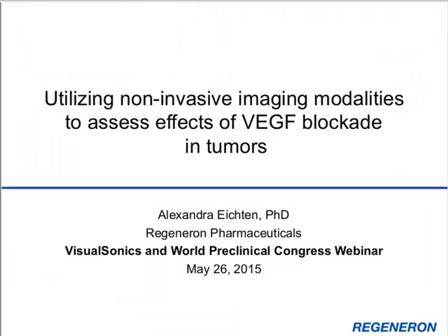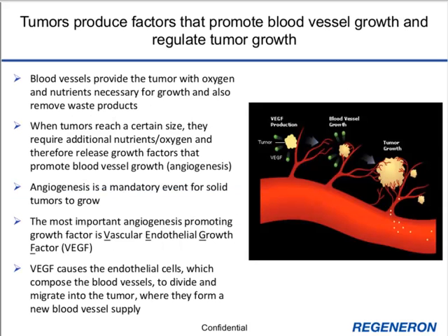I'll be telling you about our efforts where we utilize non-invasive imaging modalities, and that includes the micro-ultrasound, to assess the effects of VEGF blockade in tumors. Since not everybody is an expert on angiogenesis, I thought I'd start out with a bit of background.